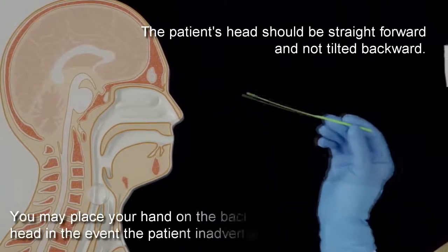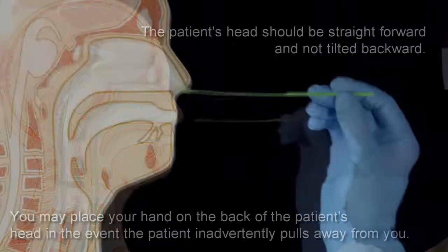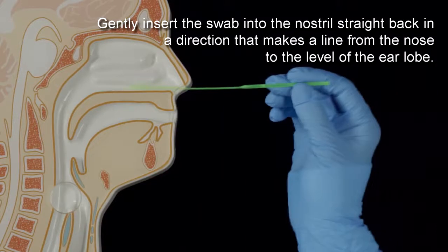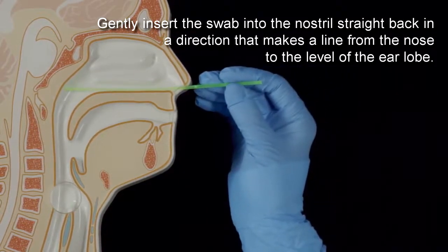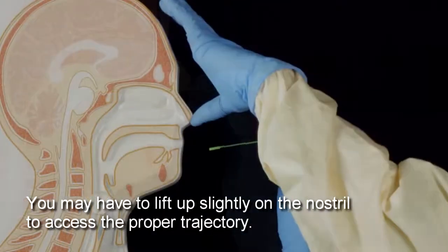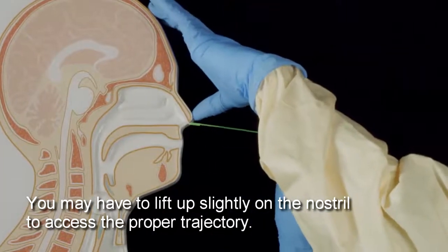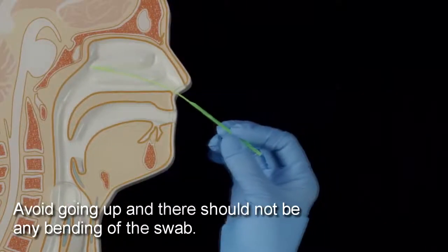You may place your hand on the back of the patient's head in the event that the patient inadvertently pulls away from you. Gently insert the swab into the nostril straight back in a direction that makes a line from the nose to the level of the earlobe. You may have to lift up slightly on the nostril to access the proper trajectory. Avoid going up, and there should not be any bending of the swab.